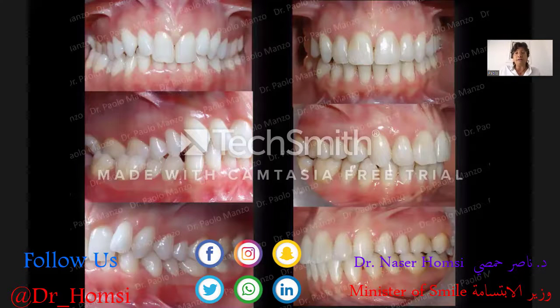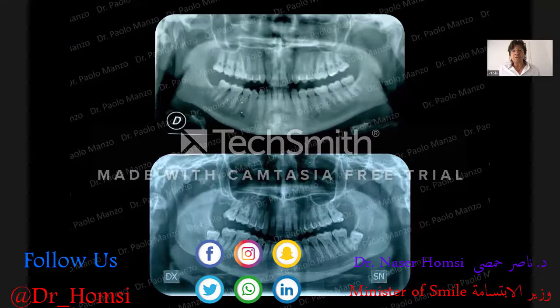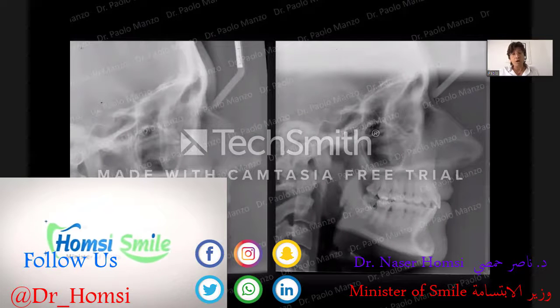So class one is important. A correction of crossbite is important, but we need to provide an interdisciplinary treatment, discussing with our colleagues since the beginning, to deliver a treatment with a second step. So this is the comparison, and this is what we would like to obtain, especially on the upper incisor, from time zero to time one and time two after prosthetic treatment. So the full correction of torque of the upper incisor.